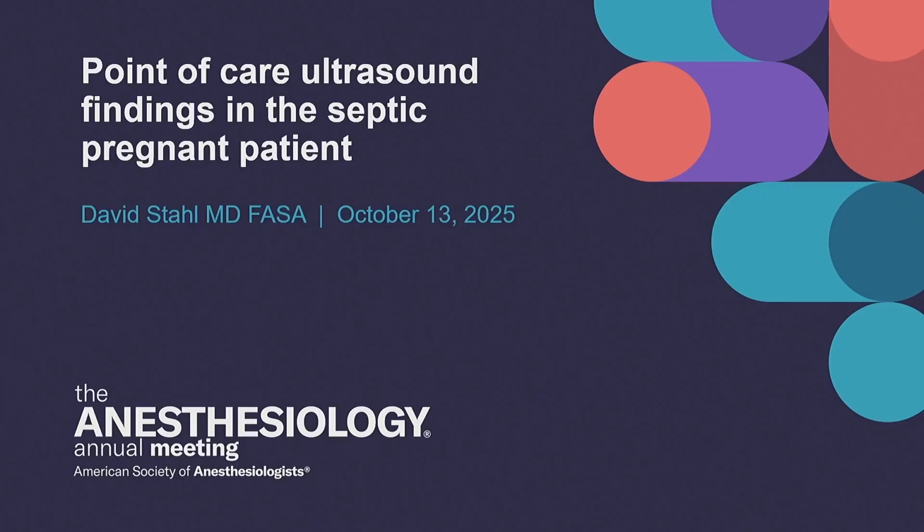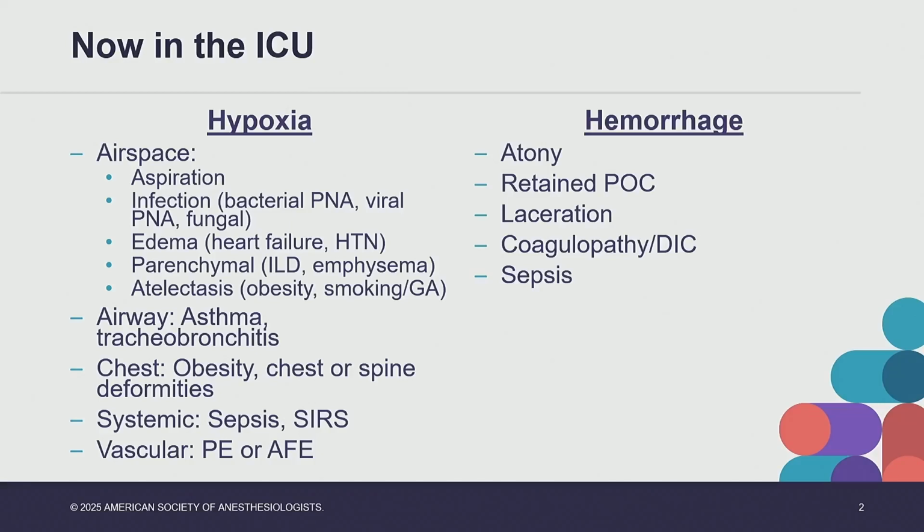All right, so now we're going to try to put this all together following the last case, this preeclamptic patient who went for a cesarean delivery, who now we find winds up in the ICU. What I want to talk about here is how to integrate these different modalities of ultrasound in the management of more complex patients. We often see that our preeclamptic patients recover from a cesarean delivery and are hypoxic.